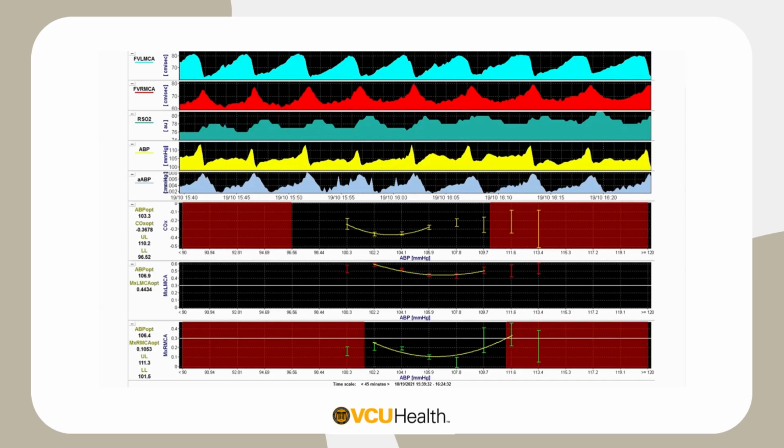I don't know how common this is. I monitored this kid maybe 3 or 4 years ago, and I have no explanation for what I'm seeing here. But I bring that up because it's a knowledge gap. Blood flow is dynamically changing in ECMO patients, and TCDs allow us to get some insights into what is actually happening.